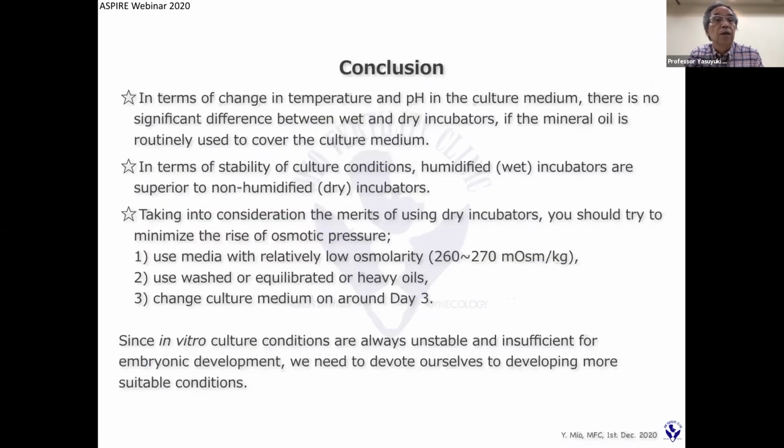In conclusion, in terms of change in temperature and pH in the culture medium, there is no significant difference between wet and dry incubators if the mineral oil is routinely used to cover the culture medium. In terms of stability of culture conditions, humidified wet incubators are superior to non-humidified dry incubators.